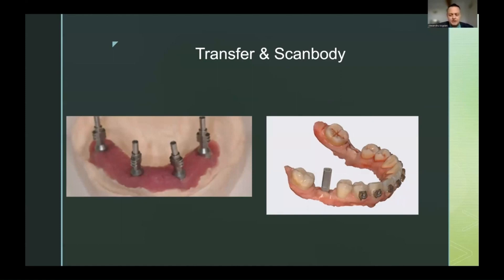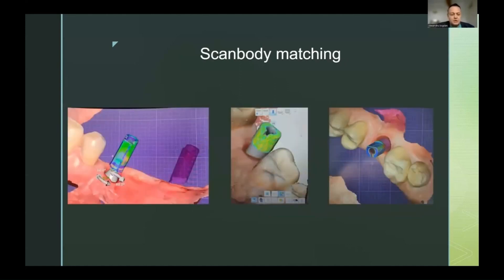Scanbodies are actually composed of two parts: one is the physical object, and the other is the library of those scanbodies. After imaging the patient, the scanbody is seated and a digital impression is done, capturing the relationship of the scanbody to the patient's teeth and gingiva. The computer then takes from the library the perfect surface of this scanbody, matches it to the mesh, and produces a heatmap that tells us how precise our scan was.